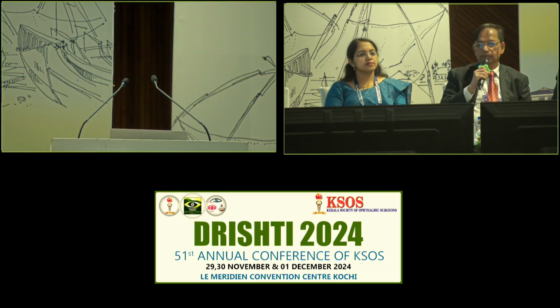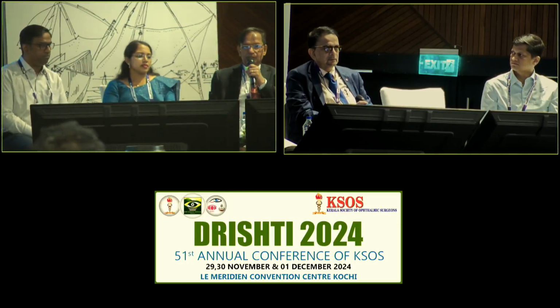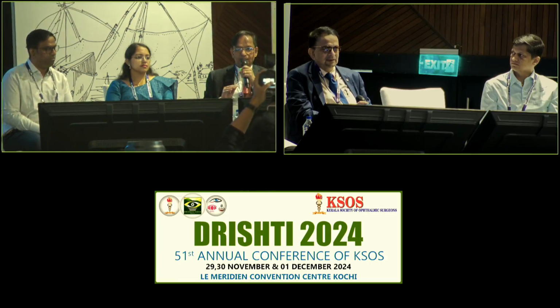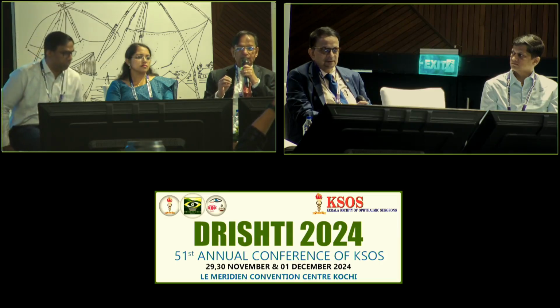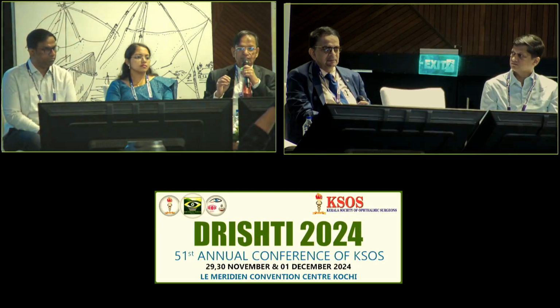This hyphema can be a bad problem in MSICS. There are 2-3 precautions. One is, as Dr. Ashish said beautifully, keep it tight. The other thing is, keep the tunnel long if you think that there's going to be hyphema, if you expect it.